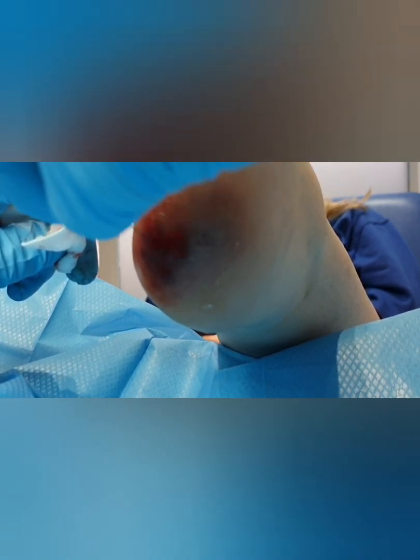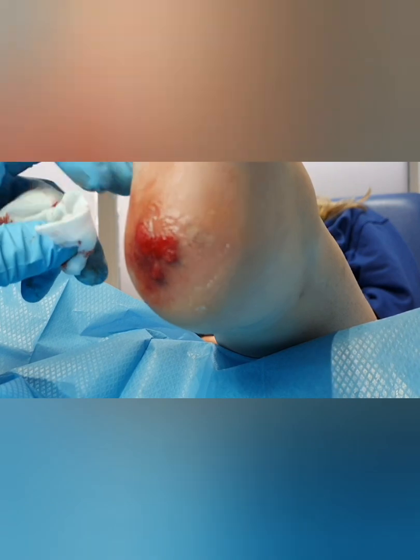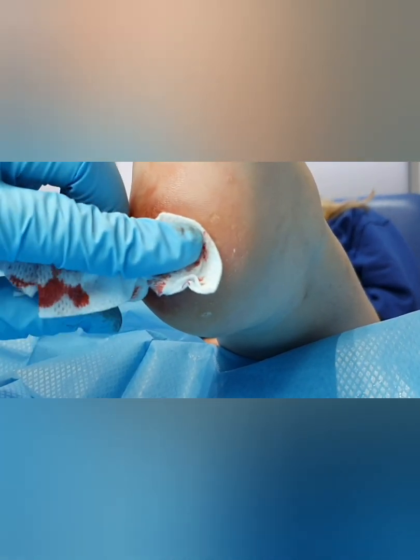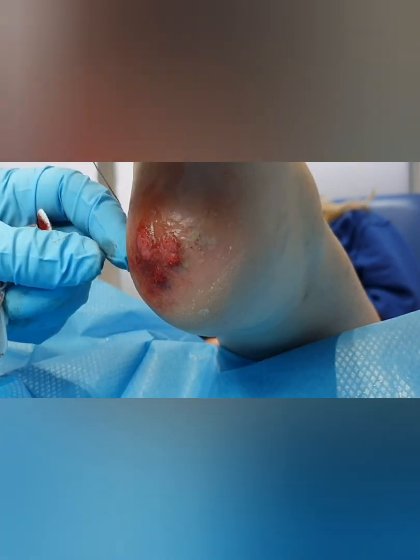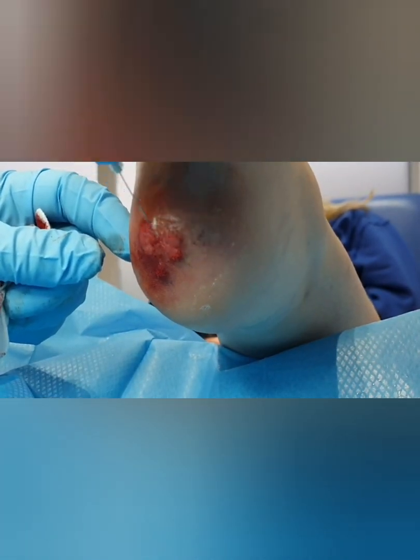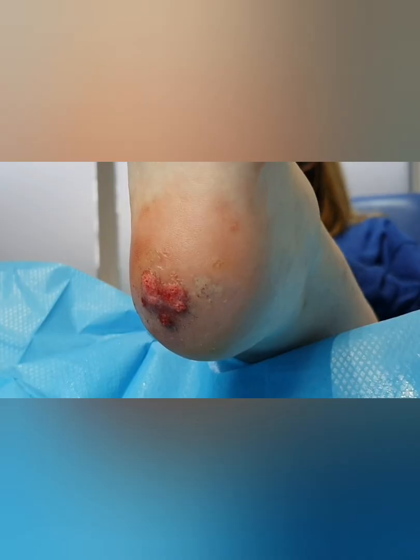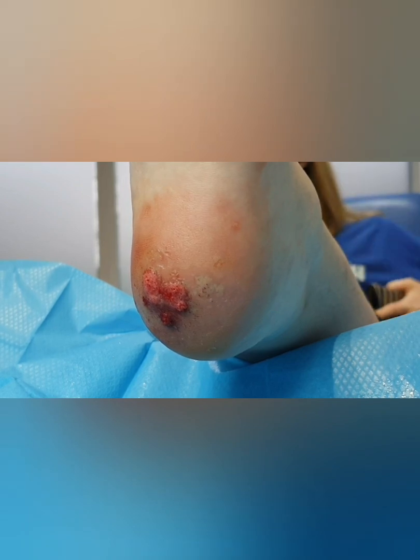There are other treatments coming up, and NICE, the National Institute for Clinical Excellence, are encouraging podiatry to try and find new methods of treating verrucas so that we can move away from the more traditional caustics, the burnings. So as you can see here, I'm done here now.